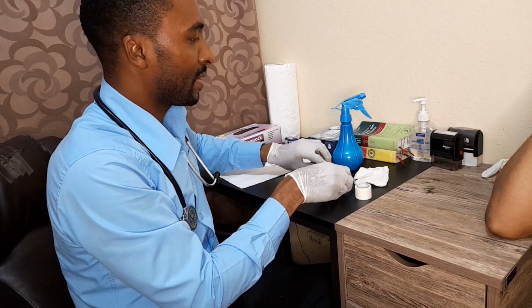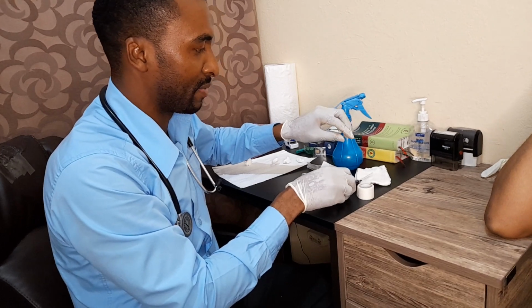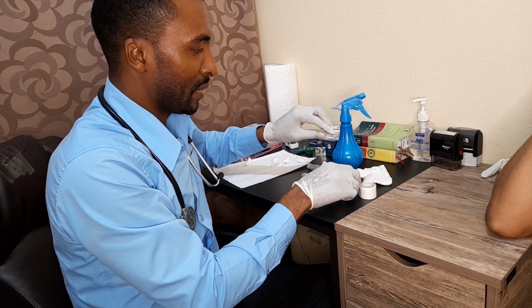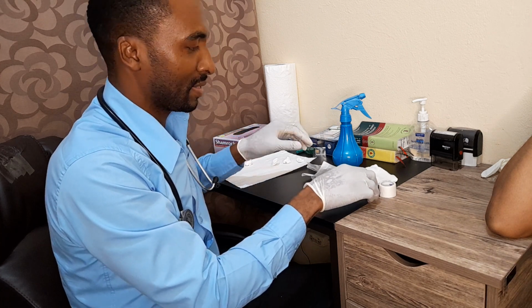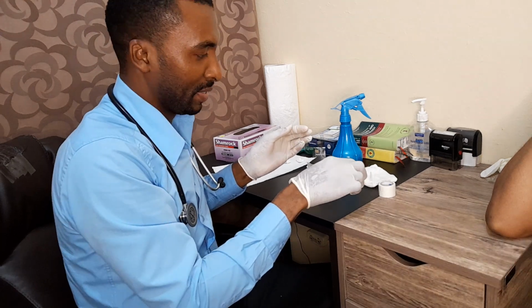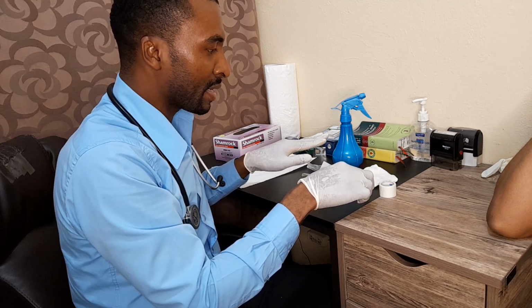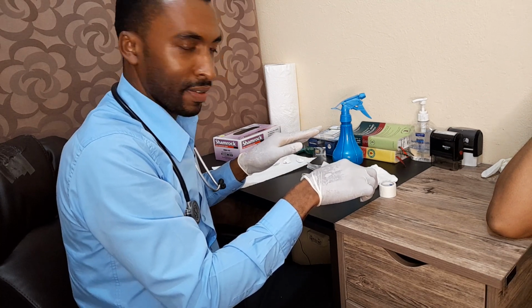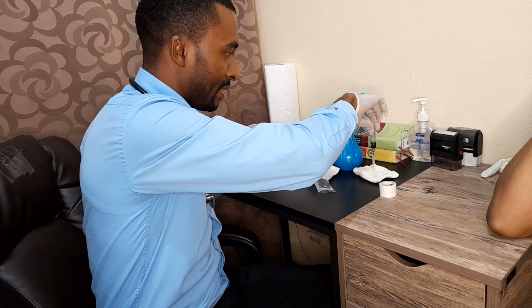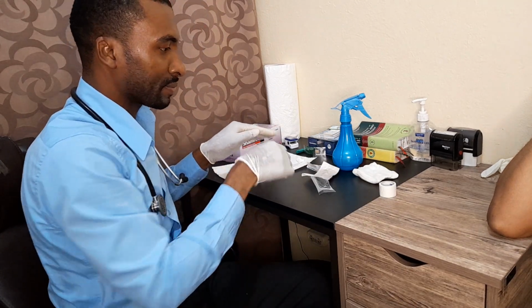Also, another aspect in which we can technically cause issues when taking blood is when we're recapping. Some doctors will encourage us not to recap, but I find that having the needle there uncapped could also be an issue. So the important thing, if you're recapping, is to ensure that the cover is on the table or on a piece of gauze, and you simply insert the needle in, come on top and push it like that, right? And then normally we discard this in our sharps container.